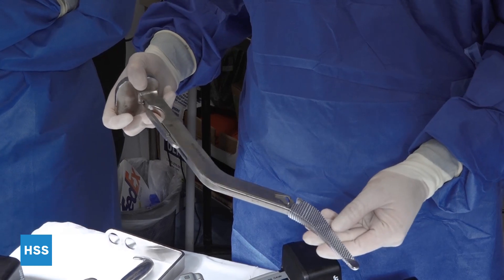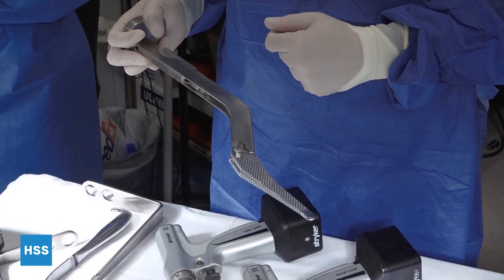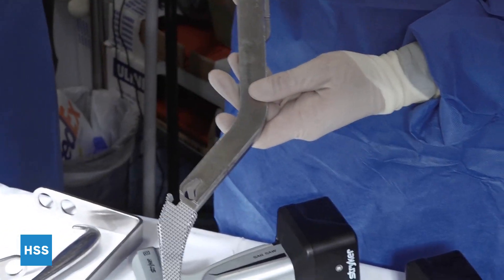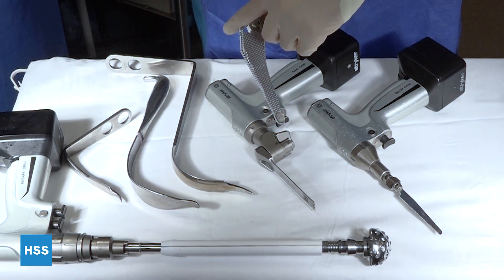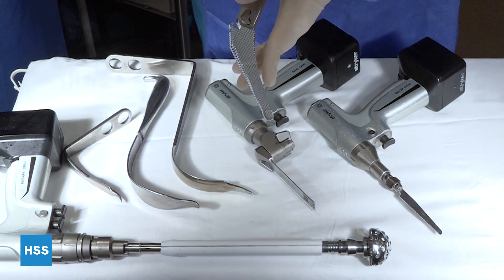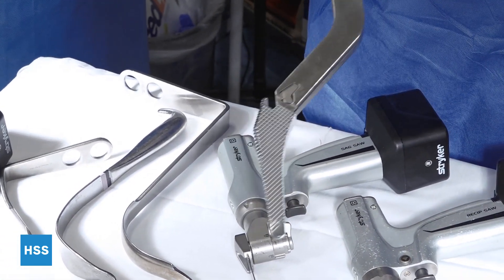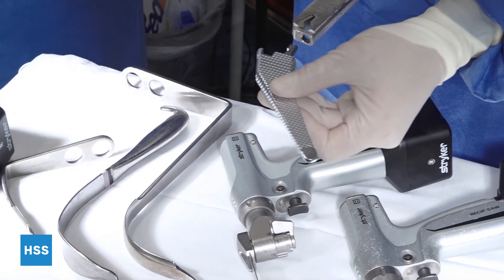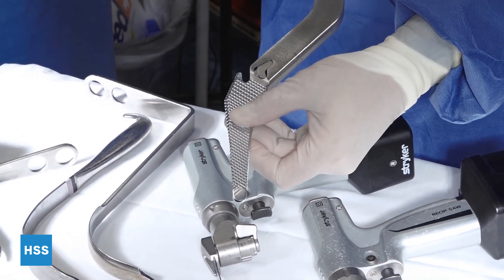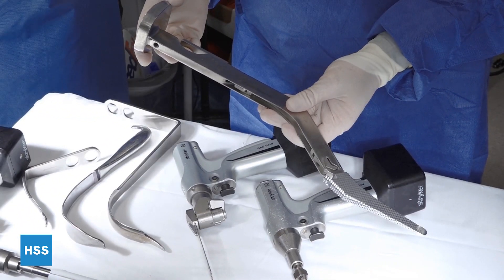Moving on to broaches. Broaches have sharp cutting edges. They're different designs based on the implant, but they match the shape of the final femoral implant. In this case, this is the lateral aspect or towards the lateral aspect of the trochanter, and this side goes along the medial calcar. All these attach to the handle in different ways, but in general they commonly have a lever that grabs onto the male portion of the broach and locks into position. And this is the strike plate for the mallet that you use with the broach.